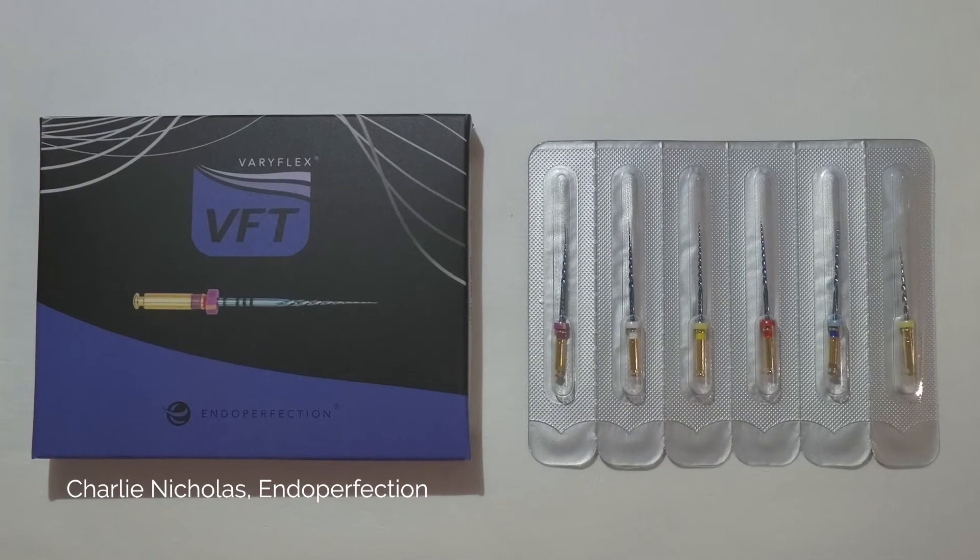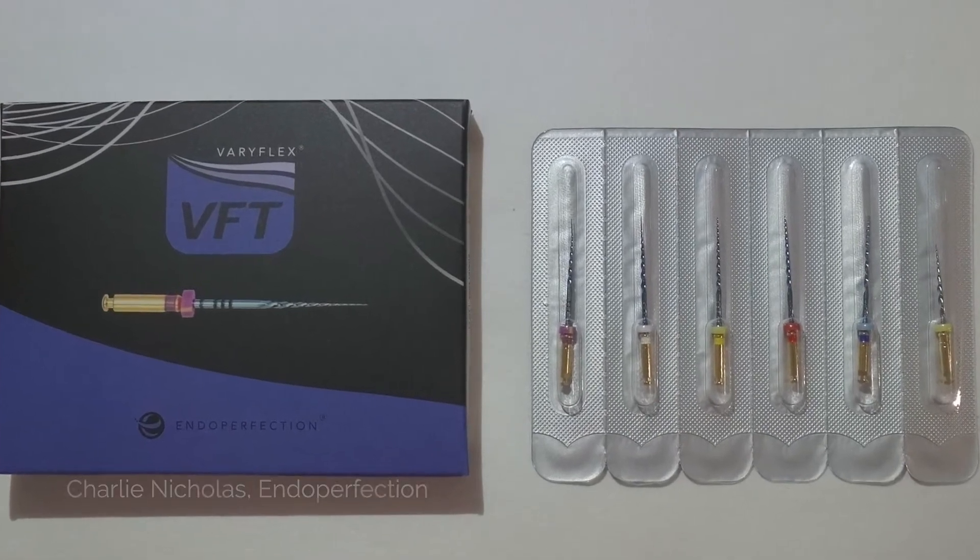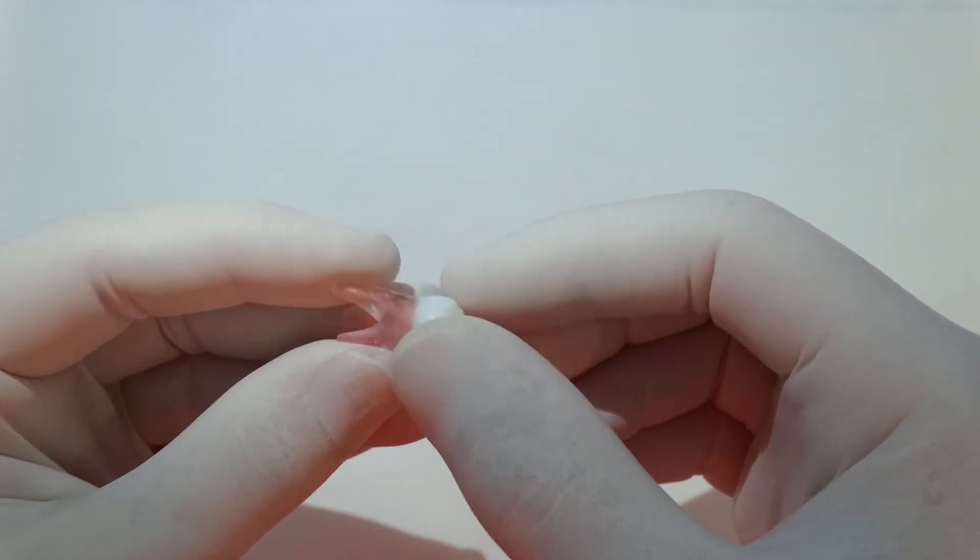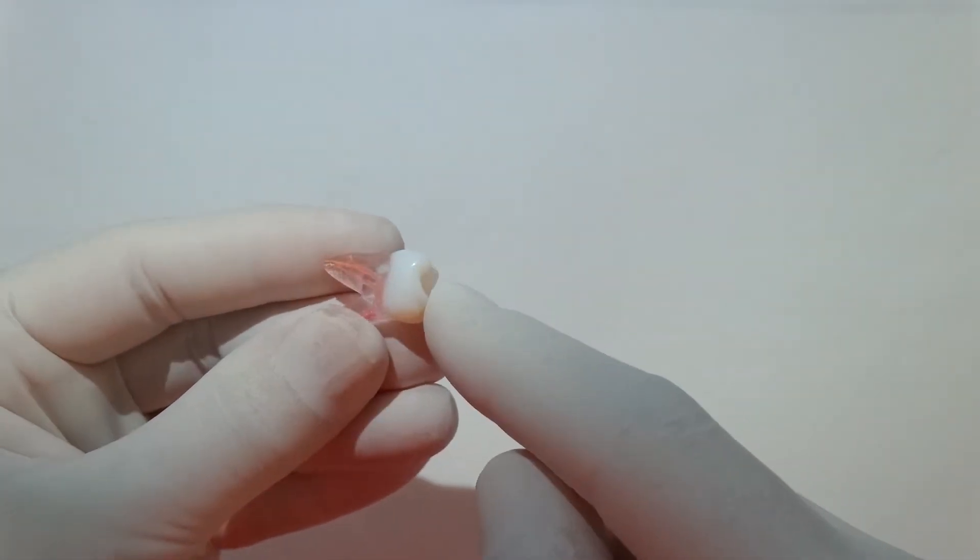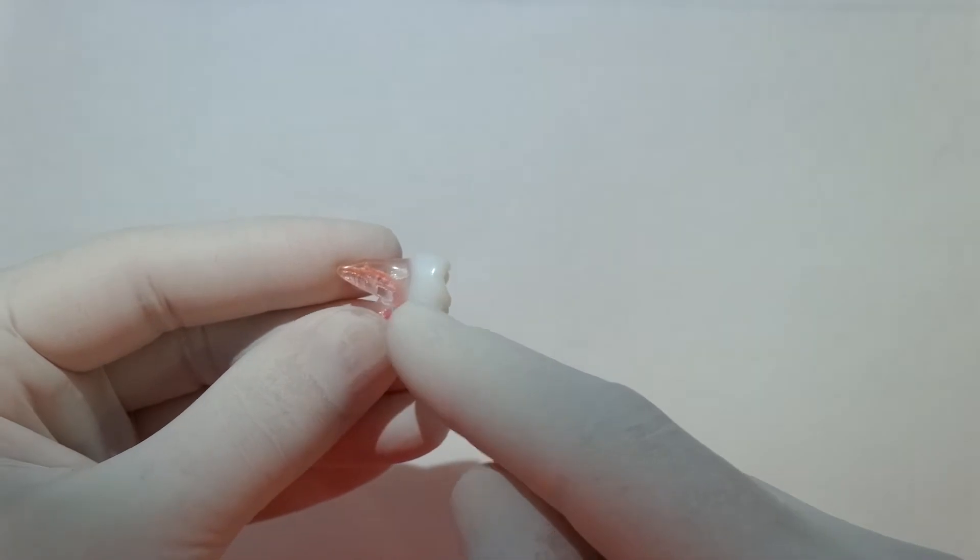Here we're just going to show you how we use our VFT Varyflex taper files. We're going to use these 3D printed teeth, exact replicas of CT scans. This is a really nice upper 6, mesiobuccal root we're going to look at today.